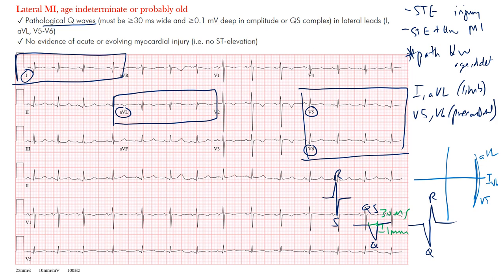The lateral limb leads — we're looking for those Q waves. Remember, no evidence of acute or evolving myocardial injury, meaning no ST segment elevation in this pattern. To code it: notice here you have these deep Q waves. Same thing here in AVL, and then barely here in V5 and barely in V6. I would almost question those in V5 and V6, but it's clear in I and AVL — in this region in the frontal plane — that you can see the infarct pattern that has happened. So just something to keep in mind there.